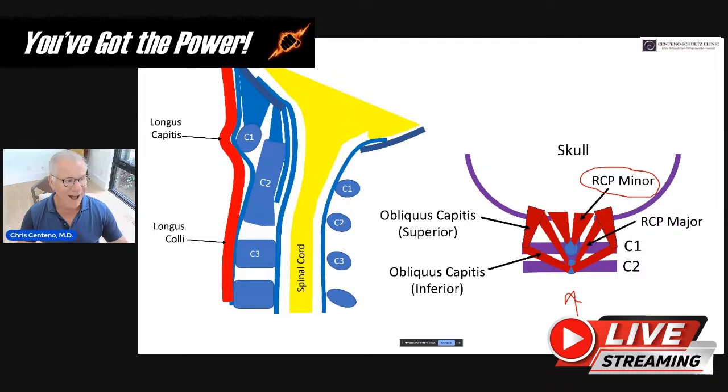In addition, it's possible to inject the longus capitis or colli up front, and realize that anytime we do a PICL procedure where we're coming below the atlas, we're automatically getting that anyway on exit. And when we go above atlas, we are also getting that on exit. So that's often included, even though it may not be checked off. It's part of what we're injecting as we go in and out.